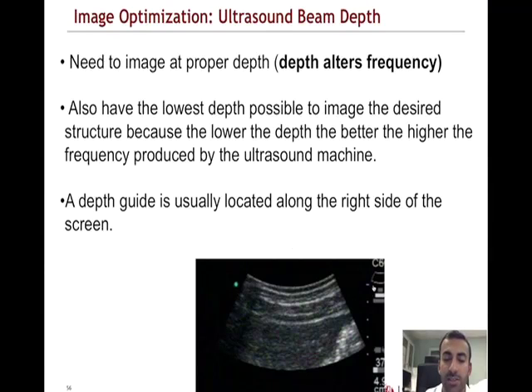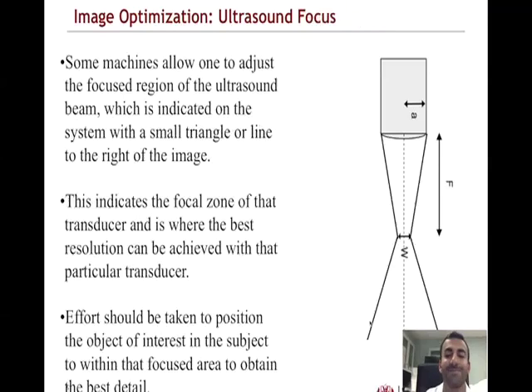Most ultrasound images have a depth guide, usually shown in centimeters, on the right side of the screen, shown here.